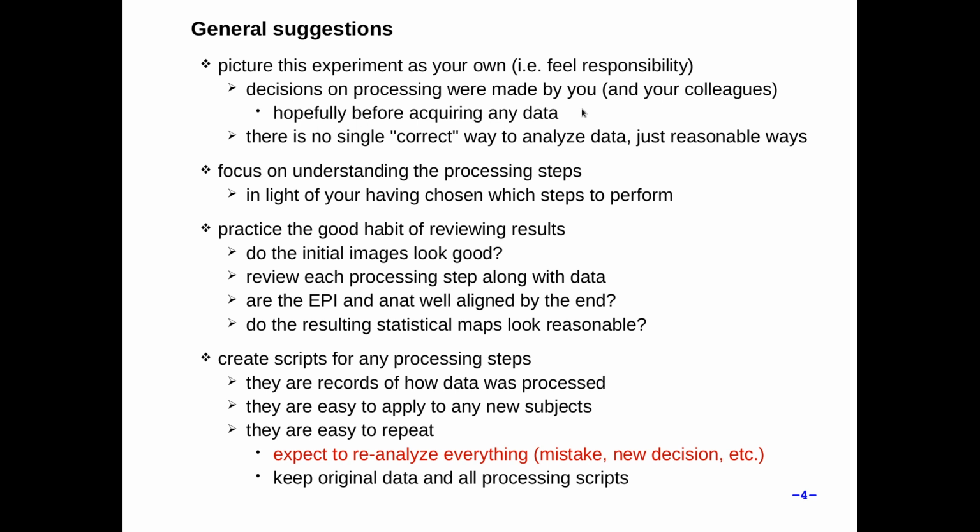Typically, you'll want to make the choices before acquiring any data, but for now, let's just pretend we're being handed the data. Note that there is no single correct way to analyze data, just reasonable ways. How to do it depends very much on the experiment in question and how the data is acquired, how big the voxels are, so many things.